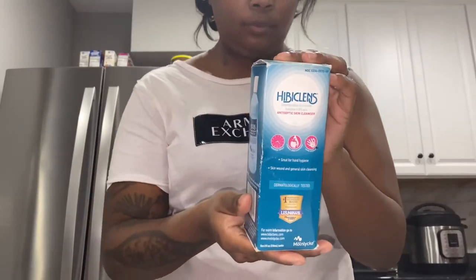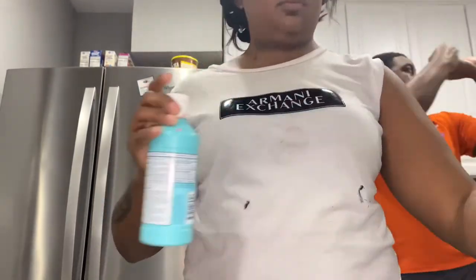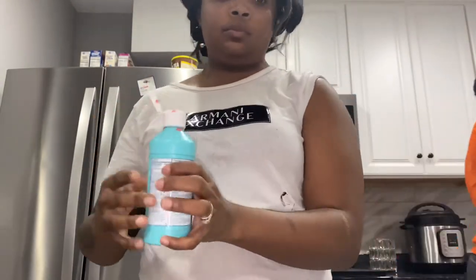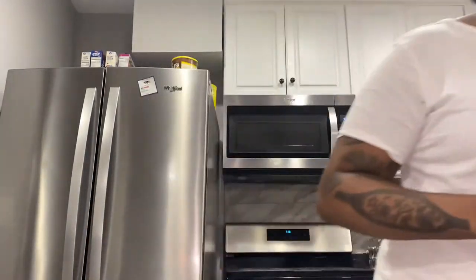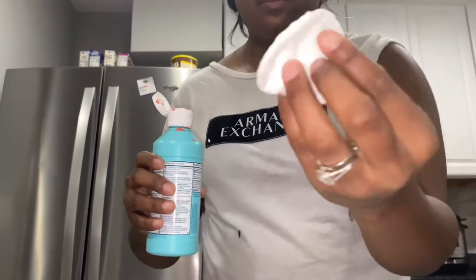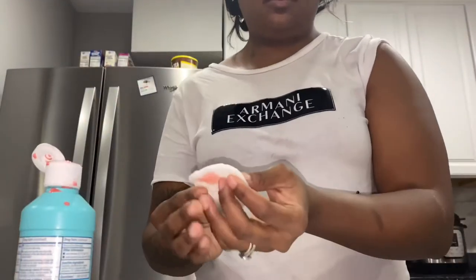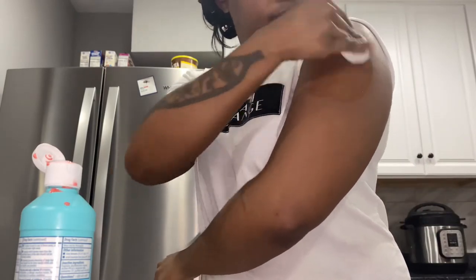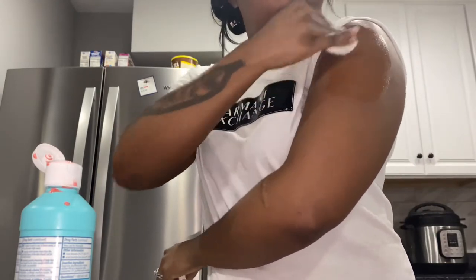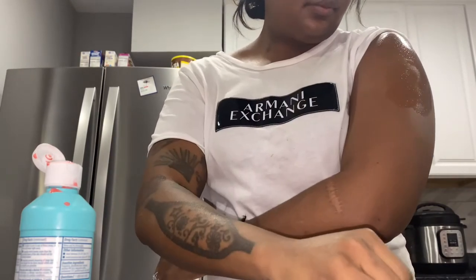I didn't have any alcohol wipes or alcohol, so I used Hibiclens, which is something that surgeons have you use before surgery — it's a sanitizer. I wet the cotton pad, applied a little bit onto it, and cleaned my arm with it. Then I took a dry cotton pad and dried my arm.